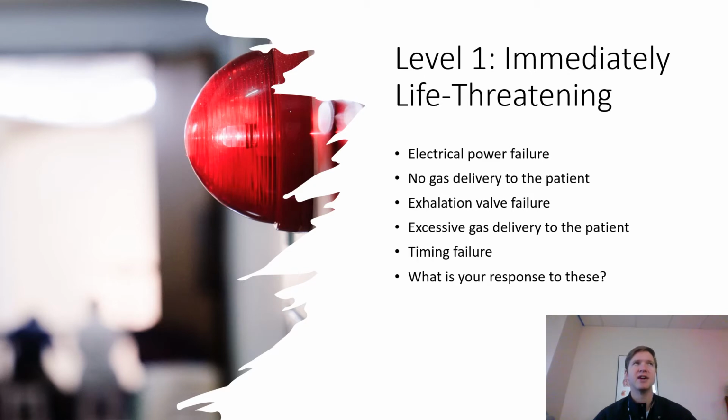If something happens there, like an electrical failure of the power to that room or to that outlet, then that's something that should alarm you, because now, thank goodness, there's battery backup. Thank goodness there's battery backup for these machines, so it could still run on a battery backup. But we need to make sure that we get power restored as soon as possible, because it's really unpredictable sometimes how long these battery lives will last. And so that's something we'll talk about.